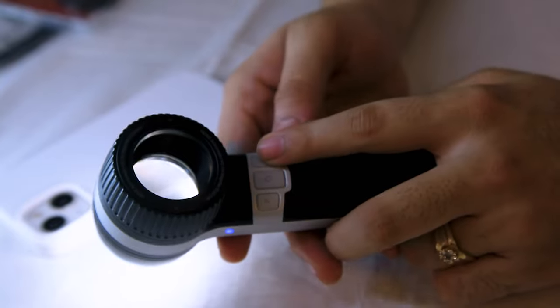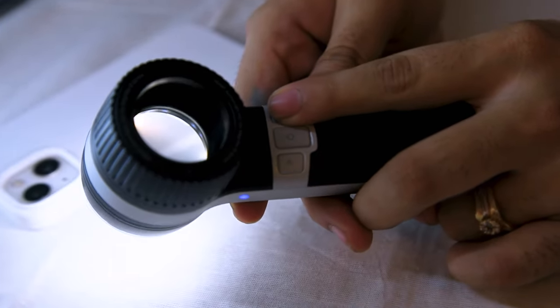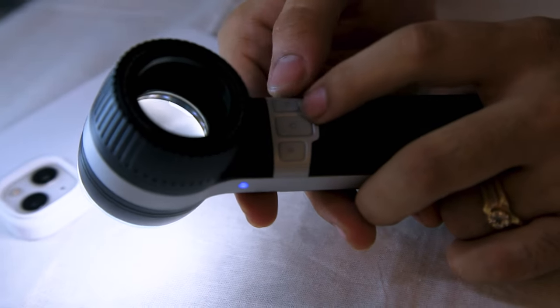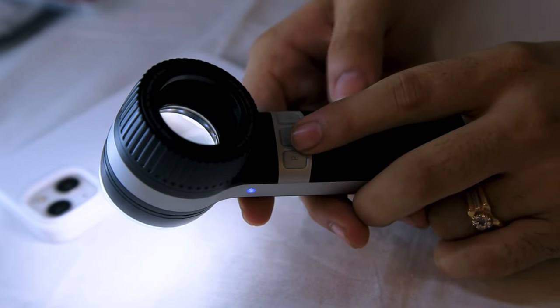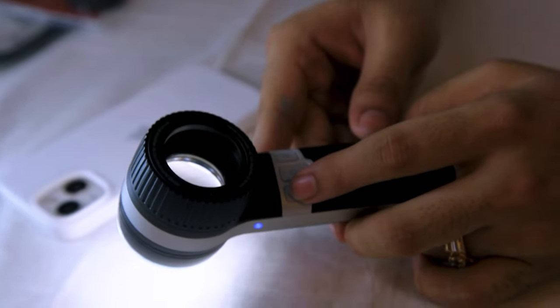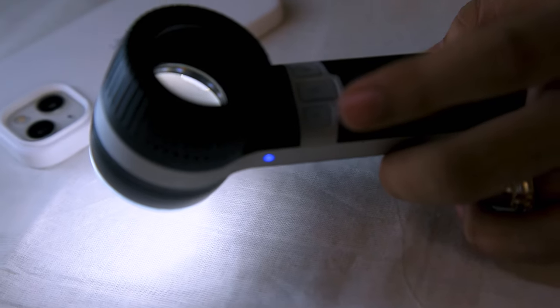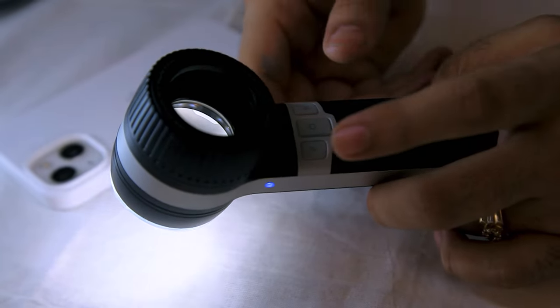The brightness control adjusts the brightness of the light. Third is the polarized button. This polarized button allows you to see the object more clearly.